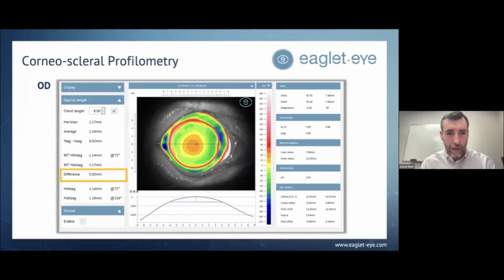As you look at the metrics, they show, again, a normal cornea, normal Ks, normal eccentricity, normal size to the cornea. There's really nothing irregular to note. On the left, that's just checking how much elevation change happens at about that 8 mm range, which is more or less where your contact lens is aligning to the eye. And it's just a nice 8 mm, 9 mm. Those are really nice chords to look at when you're looking at corneal data. And it shows very, very minimal corneal elevation changes there.